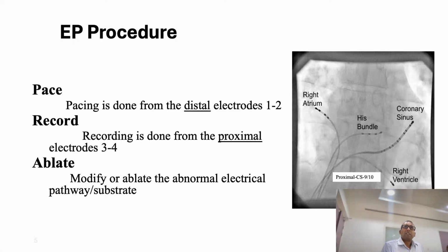So important thing here is that we have to see the proximal part. So proximal part is the signals which we have to see, and distal part we are going to. So the proximal, this is the proximal, this is a distal, and the same nomenclature here.